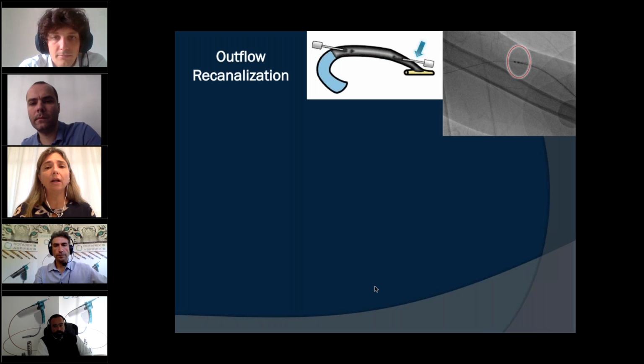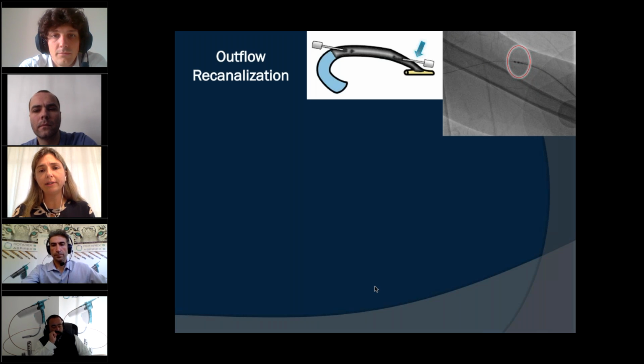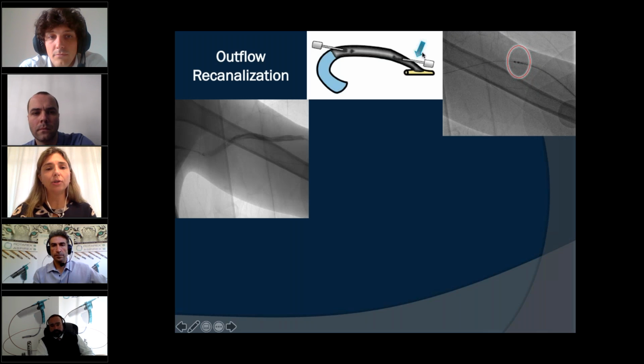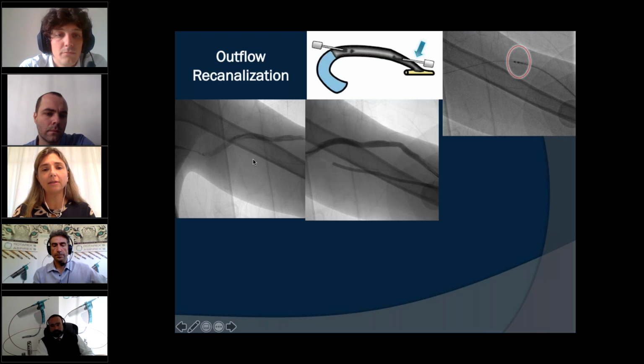This first one is a declotting and treatment of an AV graft, brachial arterial anastomosis, the proximal one, and distal axillary vein anastomosis. So I begin with an antegrade puncture in the antegrade direction of the outflow. You may see the device is a 6 French Rotarex system over an 018 guide wire through the outflow track. So this is the control after the first passage, after the second passage, with some backflow into the arterial inflow.